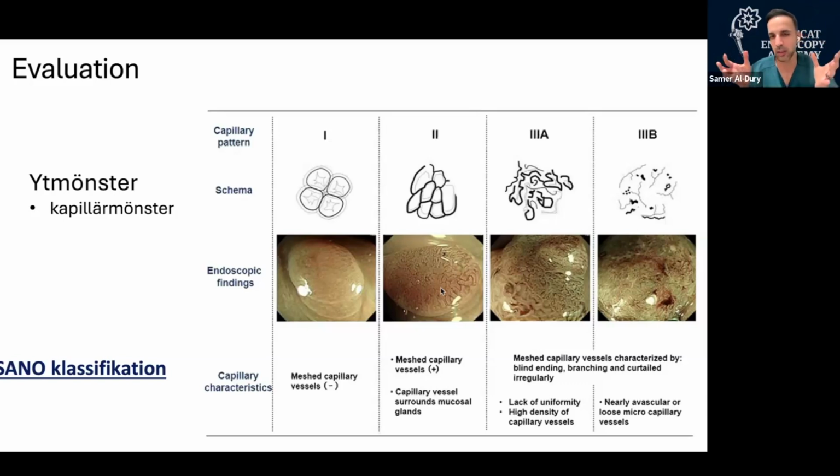One thing that people should try to do is visualize the whole lesion, right? Don't focus on just one part. Visualize the whole lesion and look at the part that looks the weirdest or the worst, because this is where your optical assessment wins. This is where you would get the best value for your money, so to speak.